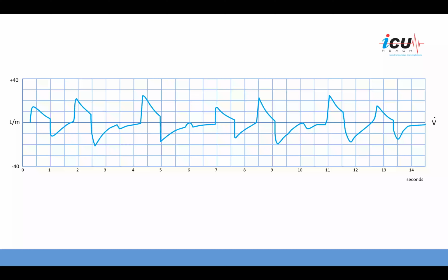The volumes that the patient took were larger. Excellent. So you can see here, larger tidal volume. The area under the curve is tidal volume. This is a flow over time, so the area under the curve is the tidal volume. Compare this tidal volume to this tidal volume, much larger. With larger tidal volume, you need longer time to exhale. And this patient started the next breath before he exhaled all the way. And the same thing happened here. You can see that this is happening again and again.